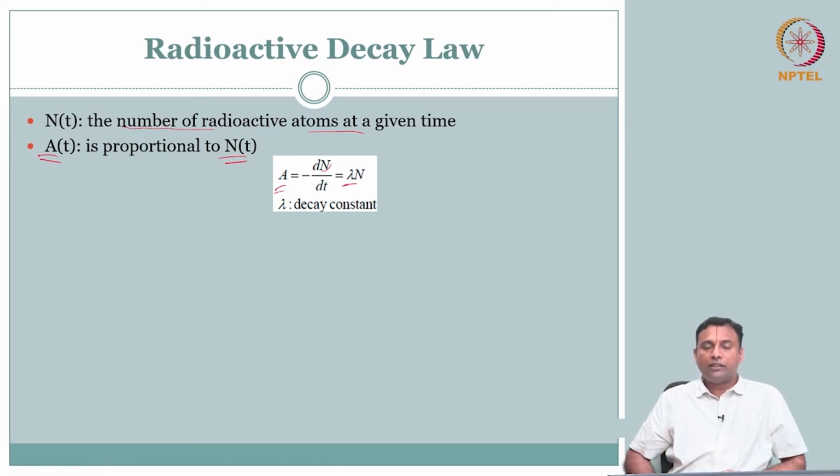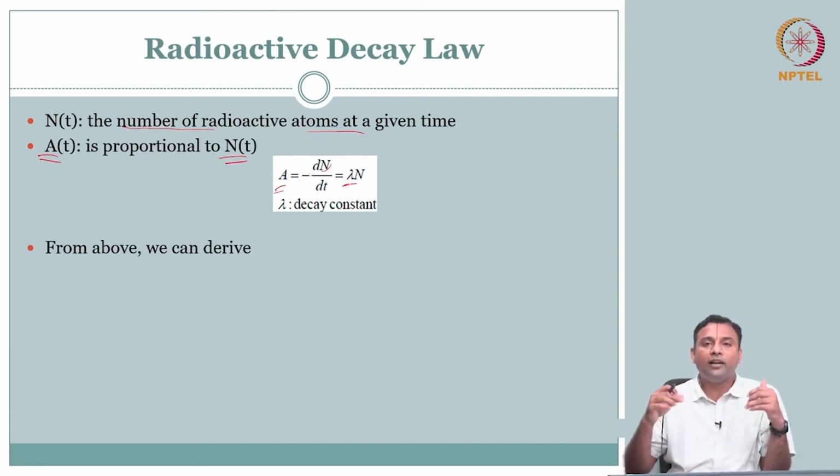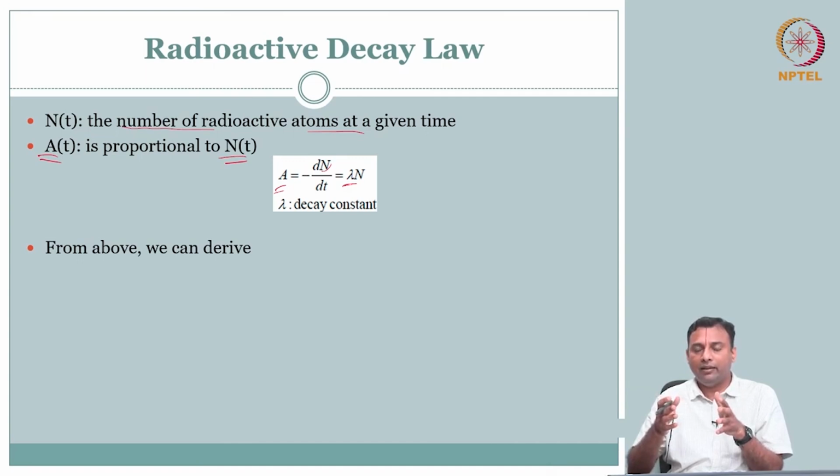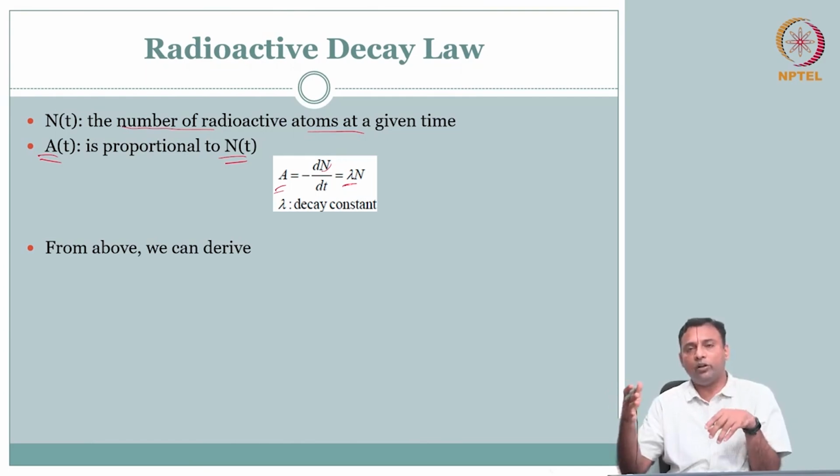If this is the case, then we can quickly rewrite. What are we looking at? When we did the X-rays, we were looking at how much energy we sent and how much came out after it crossed the material. Here we have a radioactivity and we have some time. So after some time, how much radioactivity is left? Because you send the radioactivity in, you give it some time, it redistributes itself. After that, radioactive decay is happening and you are detecting it. So you are interested in how to capture the decay rate over time.